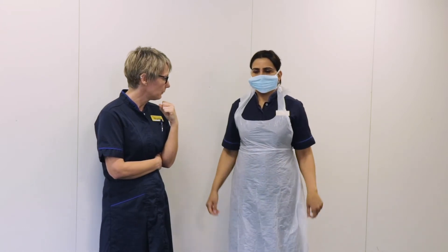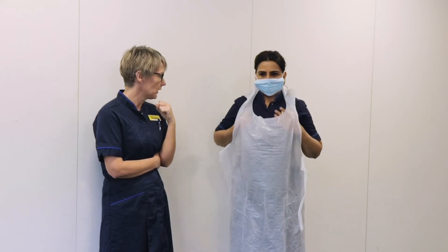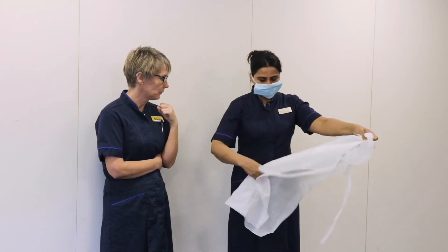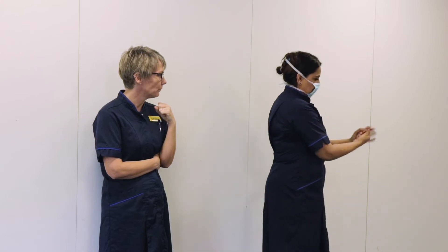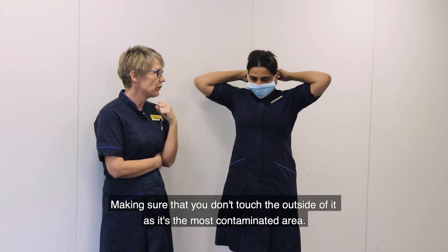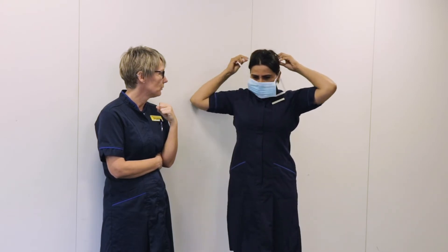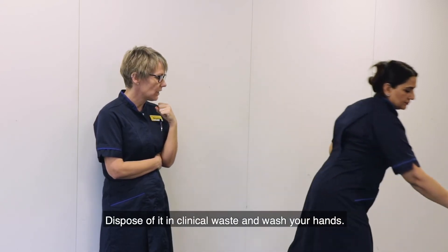Then remove your gown. Do not touch the outside of the gown — remove it gently, do not shake it, and dispose of it in the clinical waste. Then wash or gel your hands. Finally, remove the mask, making sure that you don't touch the outside of it, as it's the most contaminated area. Dispose of it in clinical waste and wash your hands.